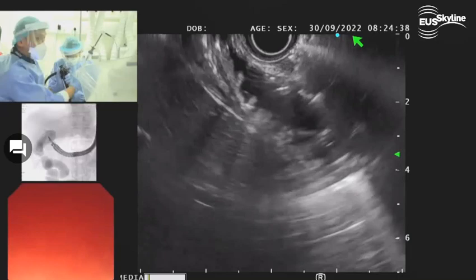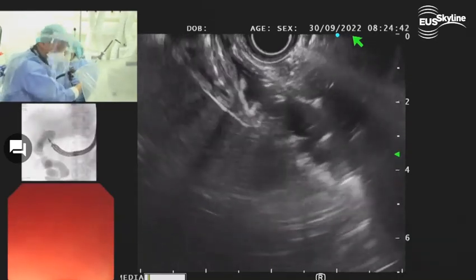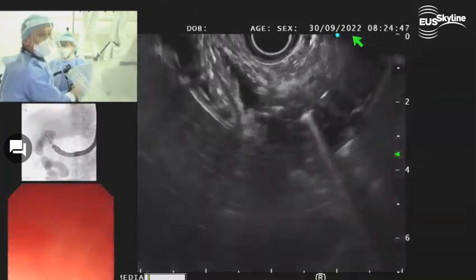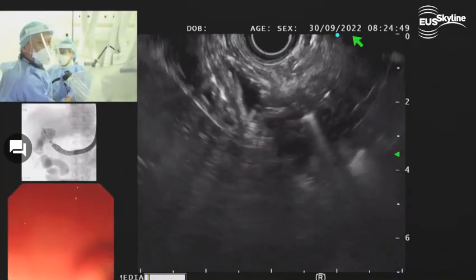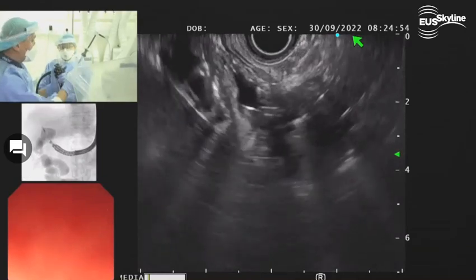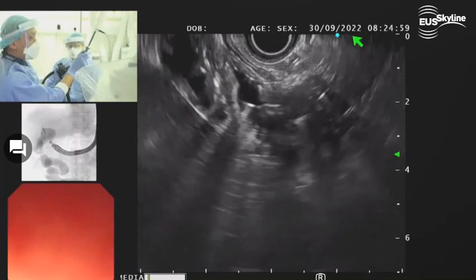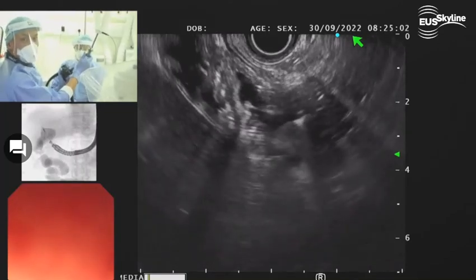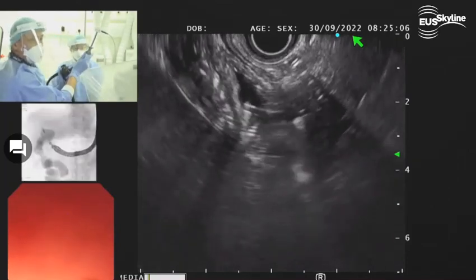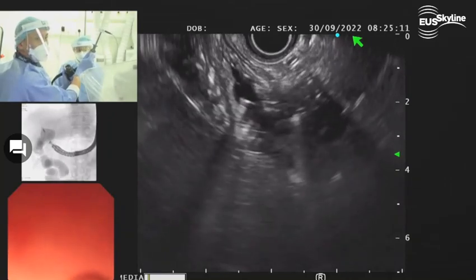So the pushing is similar to Z-EUS. All right, I'm gonna go in with the hot stent. I think I'm in. Ready? Okay, to deploy, I lock this first. I rotate 180 degrees here. All right. I open the stent slowly. Push here. We see a larger image of the fluoro.